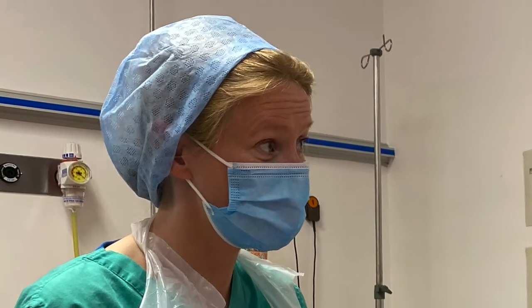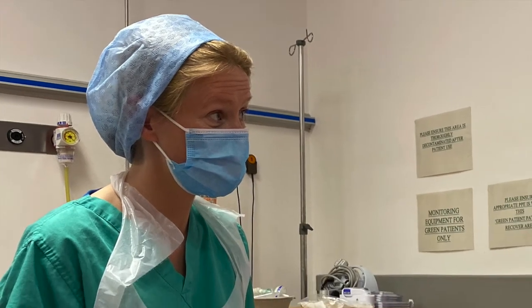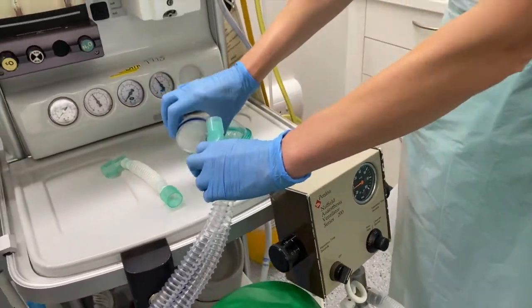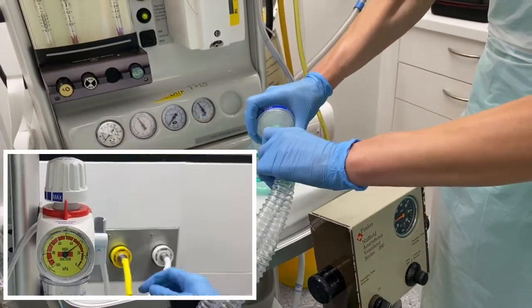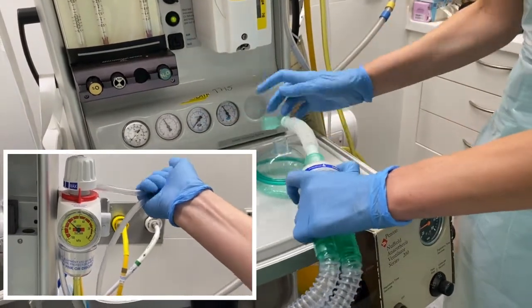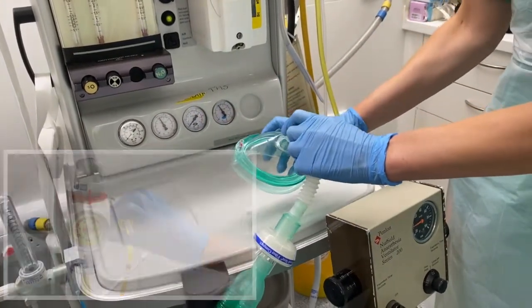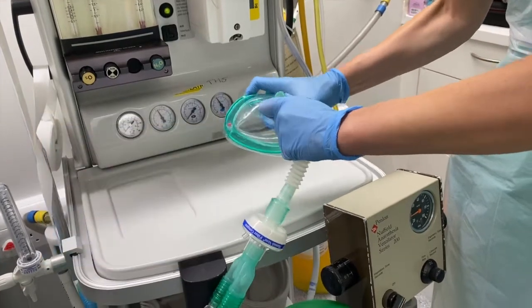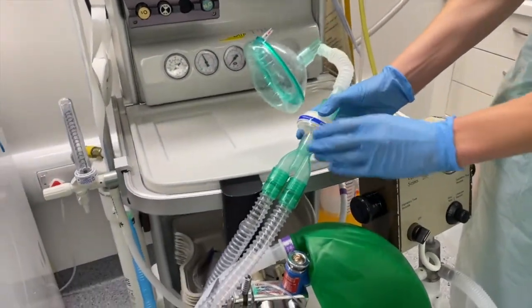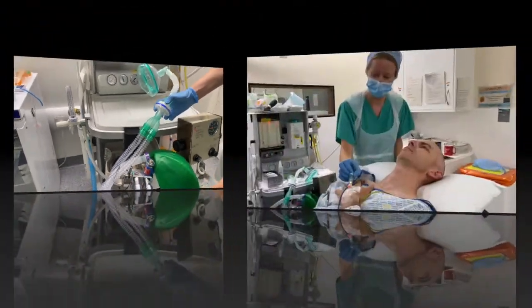Patient consent. Inform the patient that you are going to manage their airway during anaesthesia. This can improve patient anxiety and increase cooperation. You should have performed a check of the anaesthetic machine before you start, ensuring that the suction is connected and in working order. The necessary equipment at this stage includes different sizes of oropharyngeal airway, appropriately sized face mask, HME filter, and connection to the anaesthetic circuit or an ambu bag.